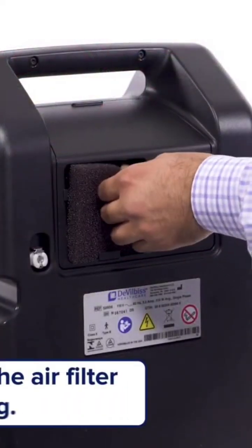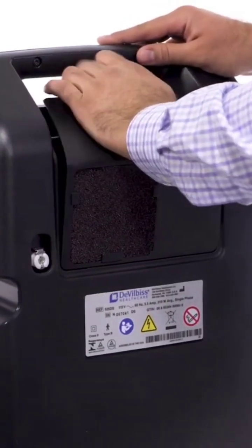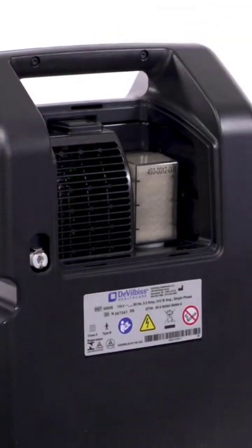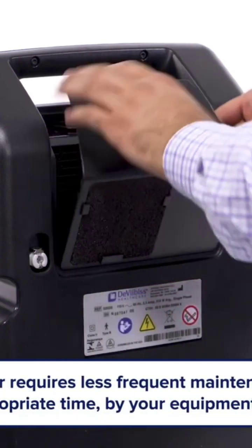Be sure the air filter is completely dry before reinstalling. Your intake bacteria filter should not be washed. This filter requires less frequent maintenance and will be changed at the appropriate time by your equipment provider.